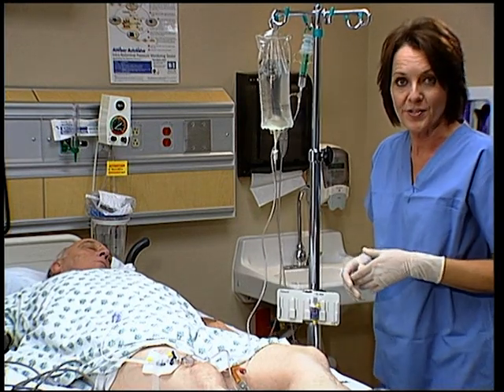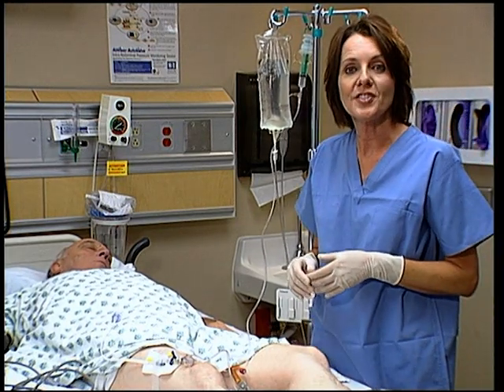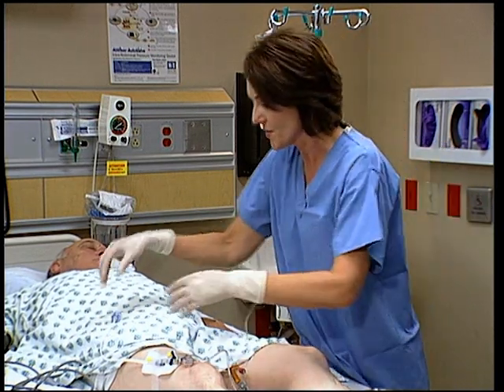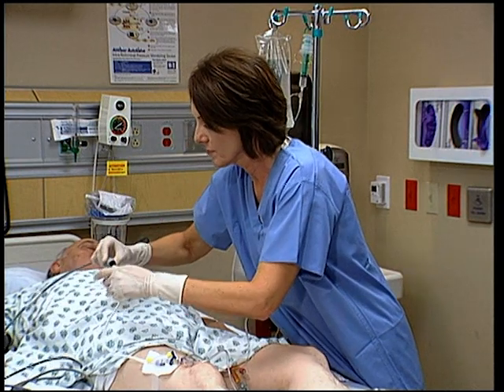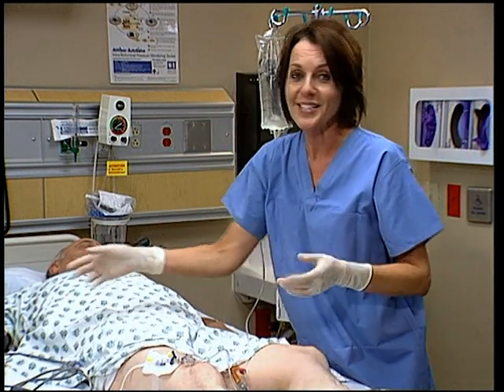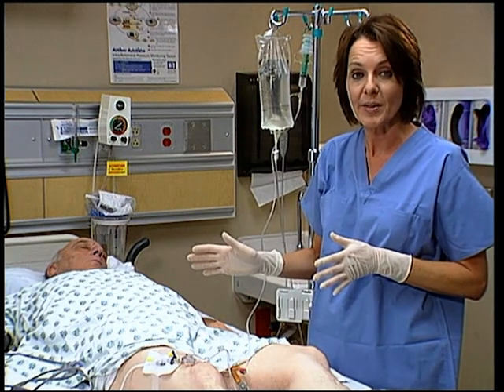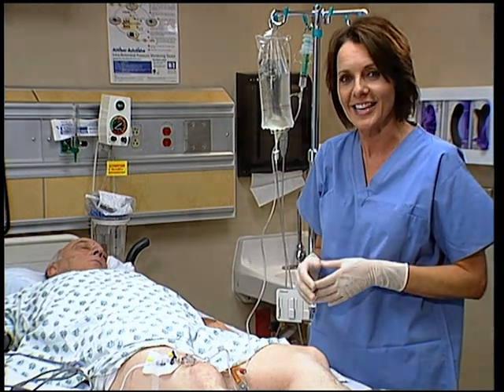Once you've mounted the transducer, plug it into your cable and monitor, and zero it just as you would normally zero an arterial line transducer. That's the hardest part. From now on, we can non-invasively measure this patient's intra-abdominal pressure in less than 30 seconds.